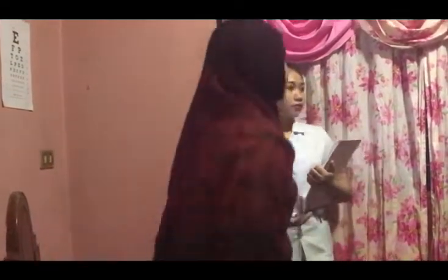So, now I need you to stand up. Okay, so in this assessment, I'm going to assess your visual acuity, whereas I need you to read the letters that are written in this Snellen chart. You can see it? Yes. Okay, so the first step, I need you to read with your right eye.